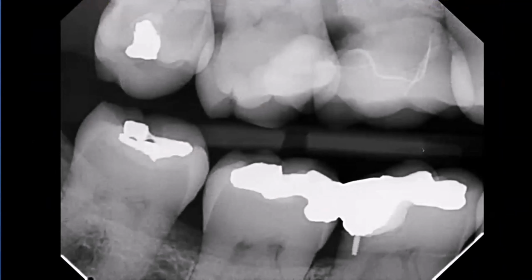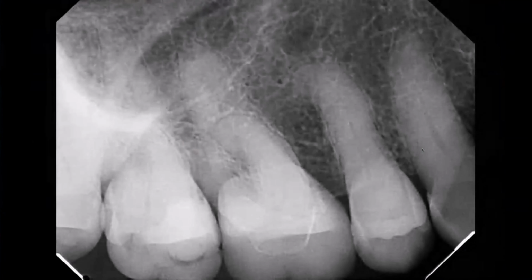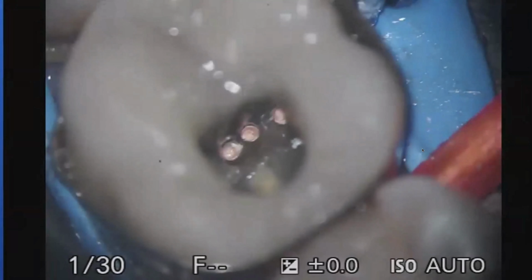So in this case, this patient was actually a dentist, and his request was, I didn't have this crown. This crown was placed not that long ago. Would it be possible to try and keep the crown? I didn't give him any promises, but at least I said I'd do my best. So this case, interestingly enough, ended up having three main portals of entry into the mesial canal system.